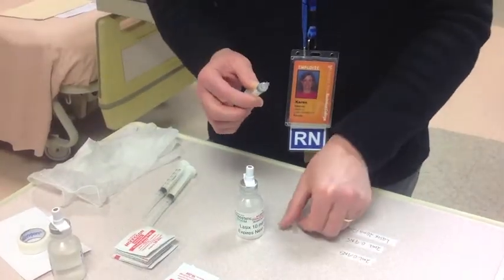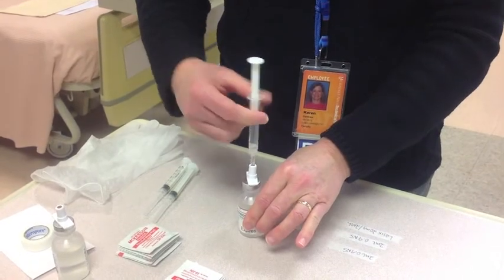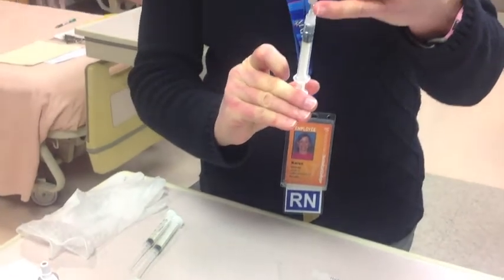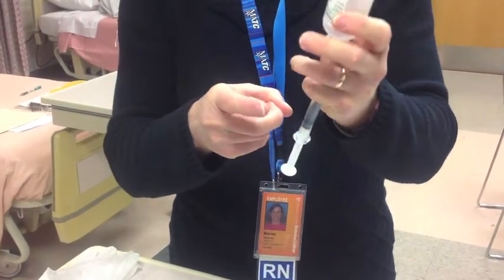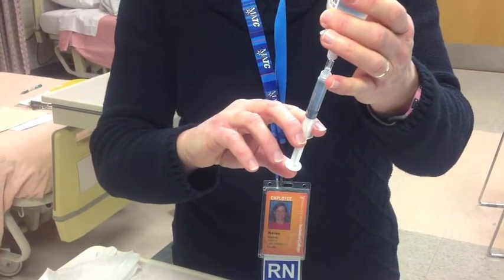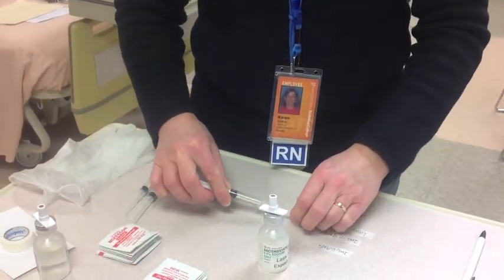Now I'm going to add 2 mLs of air to my syringe. And then I'm going to add it to my vial, air to air. And then I'm going to draw up my 2 mLs of Lasix here. And use the scoop method to recap your needle.